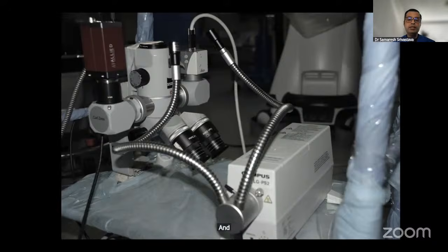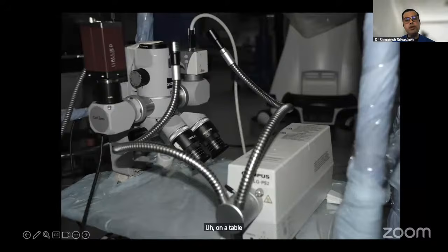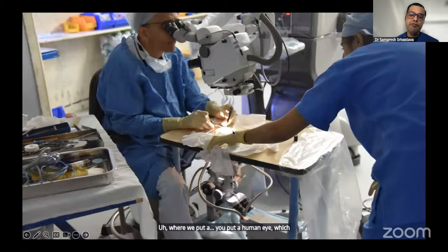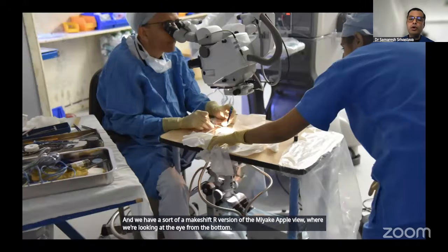And so we decided to do an experiment a few years back where we broke up an operating microscope and mounted it upside down, as you can see, on a table, which was open at the top, where you put a human eye, which was transected and then fixed on a slide. So essentially, we're recording a surgery from the top, and we have a sort of a makeshift version of the Miyake Apple view, where we're looking at the eye from the bottom to see what goes on.